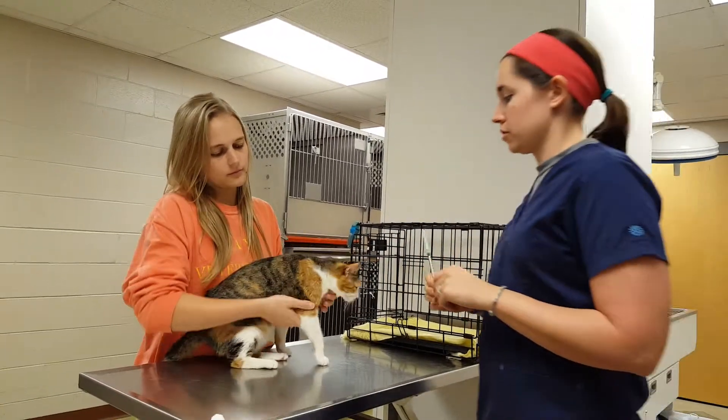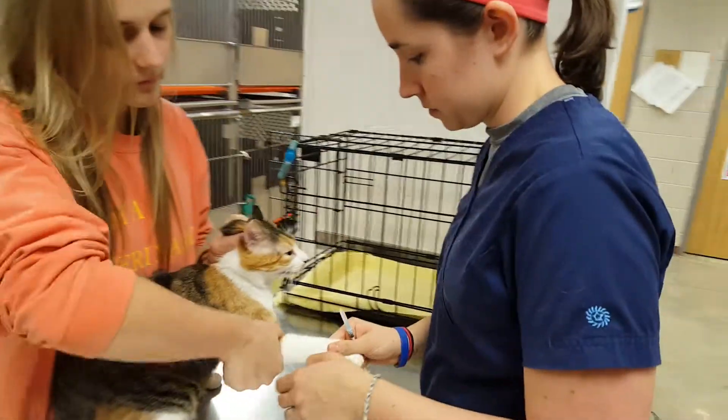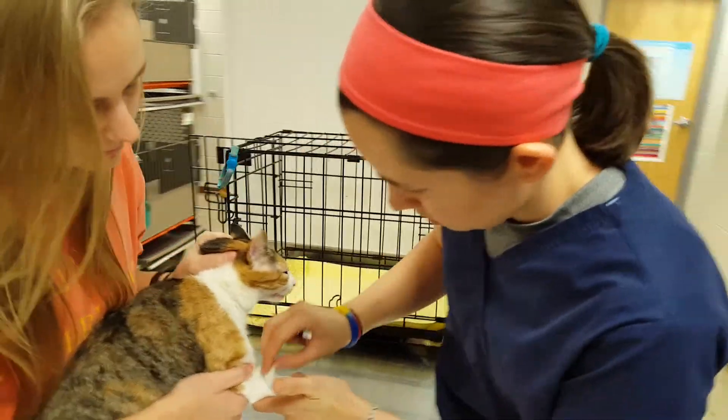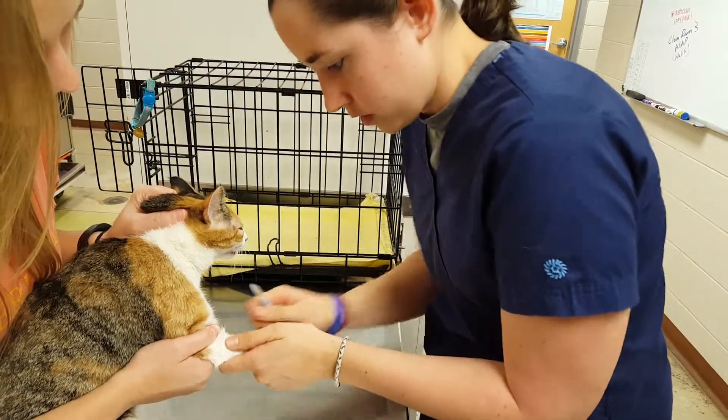If I'm the restrainer, we'll restrain and hold out the leg. I'm going to use my swab to swab the area, put some of that hair down and distend the cephalic vein.